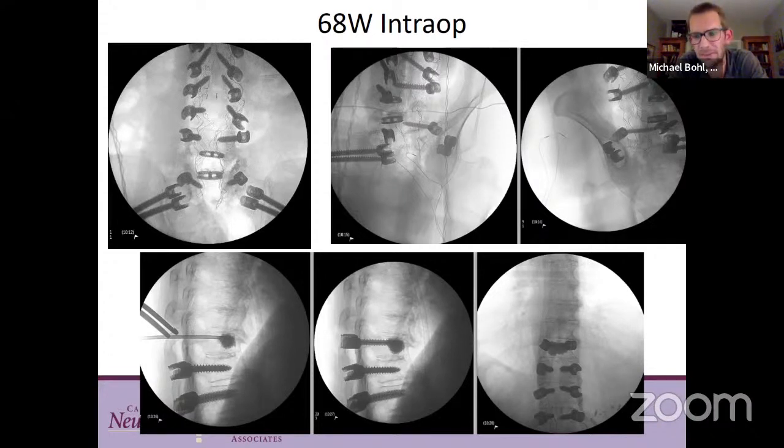You can see 4 iliac fixation points. I'm a big fan of 4 separate iliac fixation points with a separate rod attaching to each one of those fixation points. I think that does provide excellent spinopelvic fixation when each rod has its own pelvic fixation point. You can see those on those intra-op views, on those teardrop views. And then I like to cement the top for long segment constructs. That's something I've been doing now for a while and do believe in the utility of.